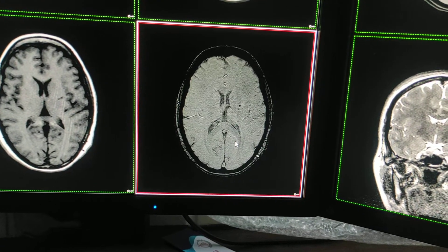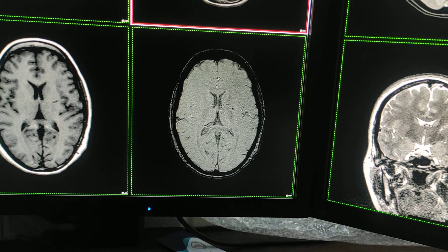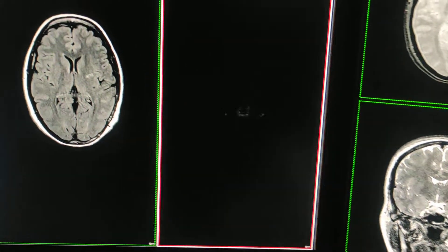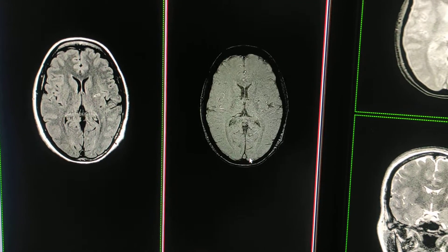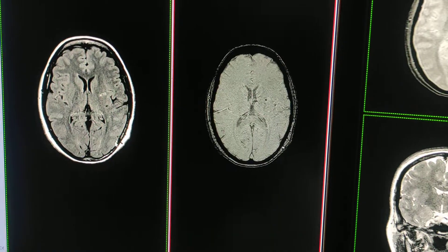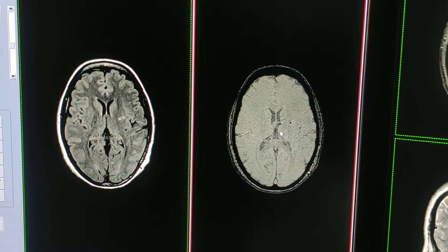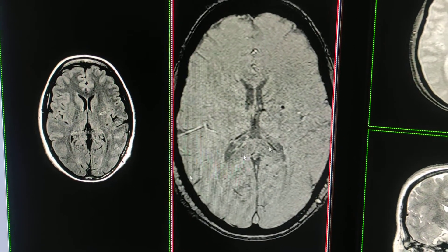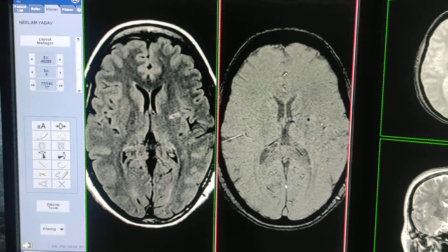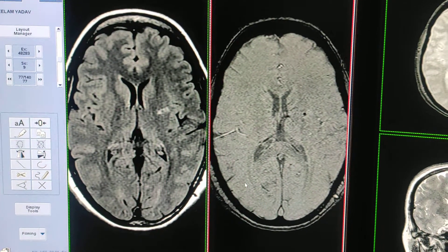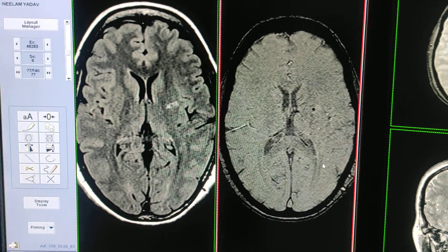Now I will show you the dark lesion seen on the SWAN sequence. Sometimes there will be tiny bleeds or hemorrhagic infarcts too. You can correlate with the FLAIR — in the SWAN sequence here is a tiny lesion, and here is a tiny lesion seen as well. This is how you use this sequence to properly diagnose calcifications, tiny bleeds, or iron depositions.